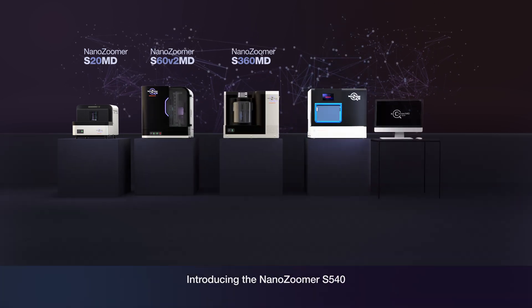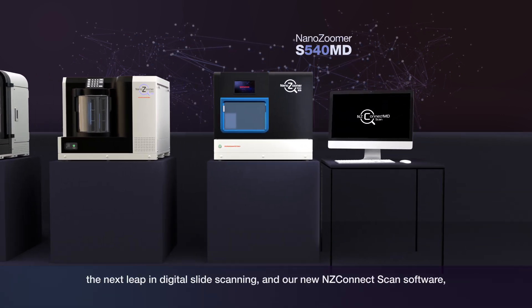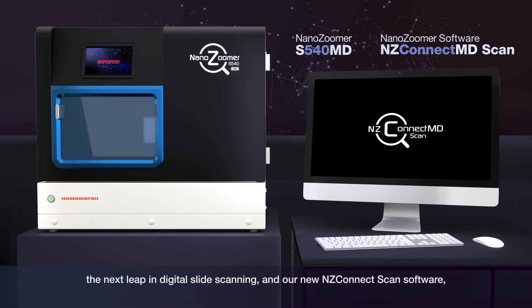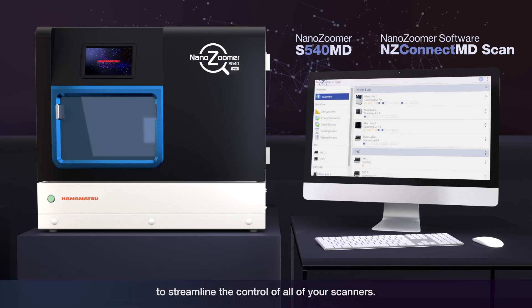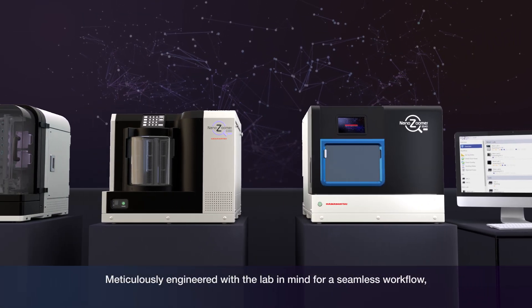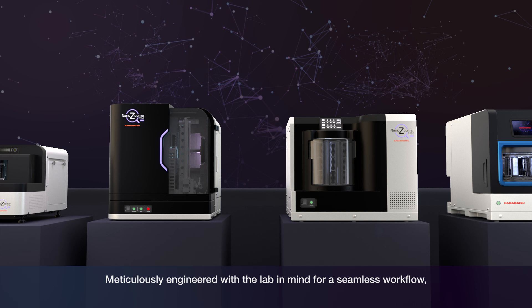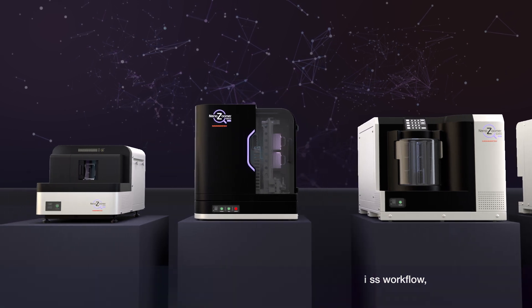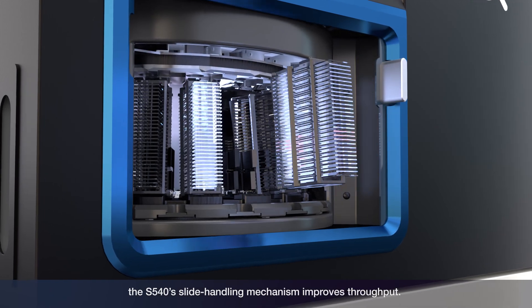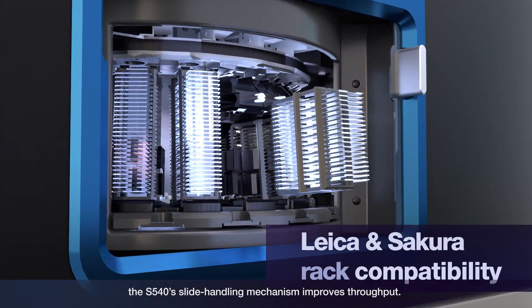Introducing the NanoZooma S540 — the next leap in digital slide scanning — and our new NZ Connect scan software to streamline the control of all your scanners. Meticulously engineered with the lab in mind for a seamless workflow, the S540's slide handling mechanism improves throughput.